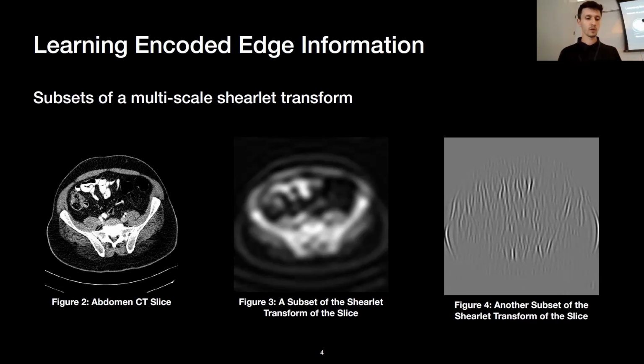One analogy that I like to make, which might help visualize what the Shearlet transform is actually doing: you can picture a convolutional neural network, and after it has finished training, you have a look at the feature maps. You see that some of them tend to learn or encode information regarding the general objects that have been provided in the training images, while some feature maps tend to learn intrinsic small primitive patterns, for example, half a circle or a straight line or such patterns. This is a similar scenario for the Shearlet transform output.